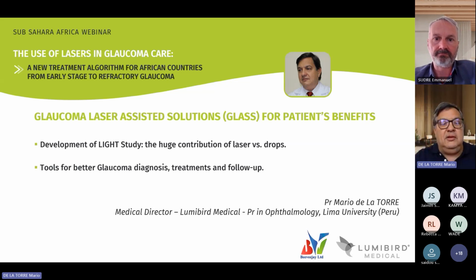This is very important because we have the proof of concept in the development of the LiGHT study. The LiGHT study opened the doors to all of us in the scientific community to be convinced that SLT is the first line, also together with the eye drops.